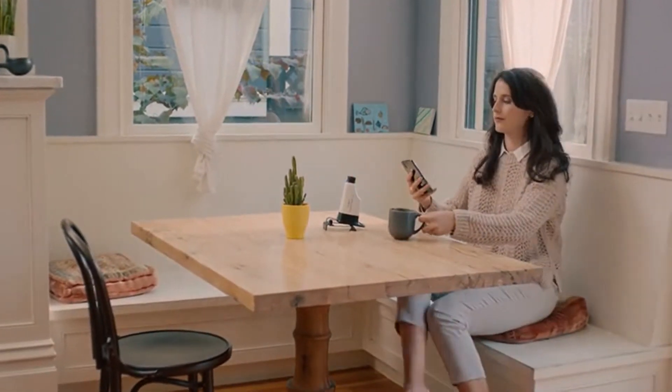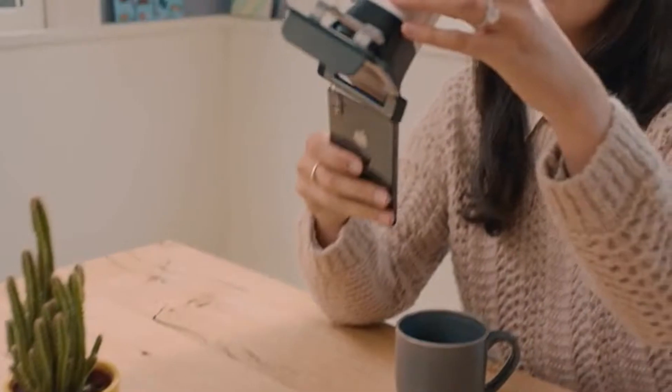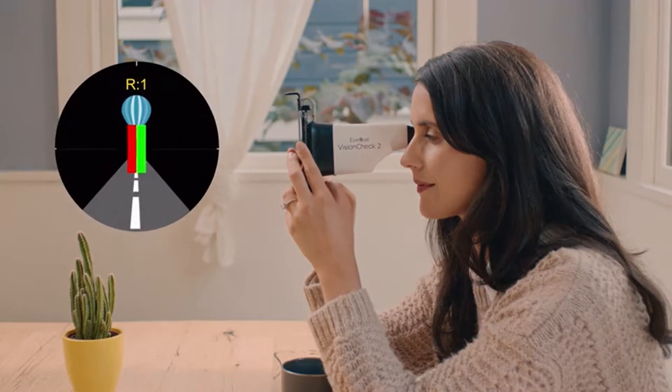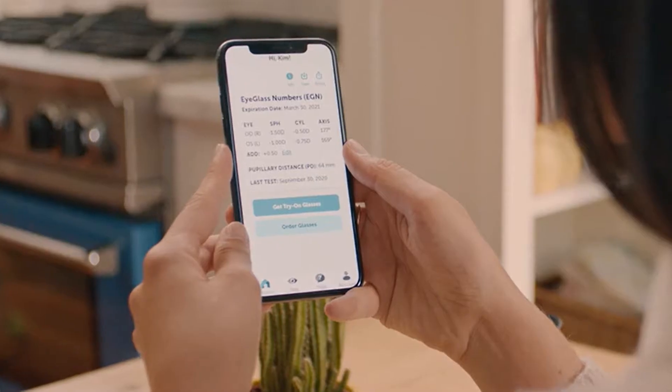iCUE is a smartphone-based solution that lets you test your vision at home. Simply connect the VisionCheck 2 to your phone, and the easy-to-use iOS or Android app will guide you through a series of game-like exercises. After completing a few sets of tests, you'll receive your eyeglass numbers to order new glasses online.